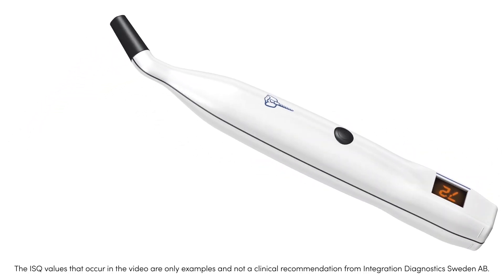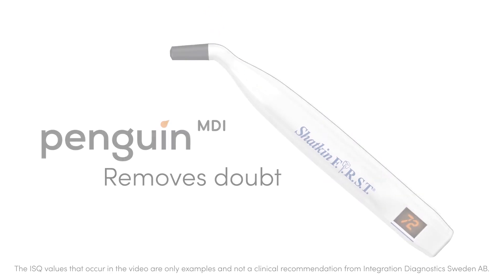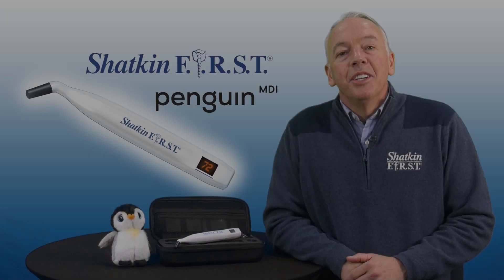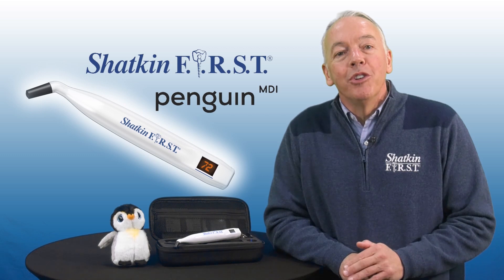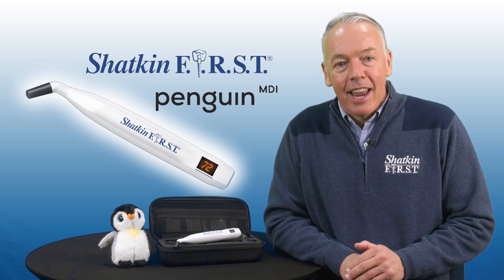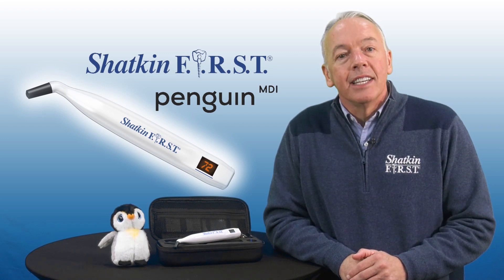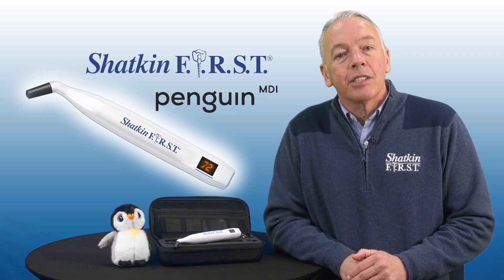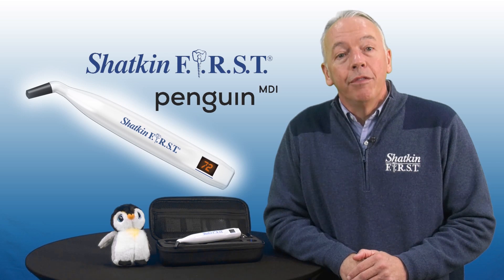The Penguin MDI is available exclusively from Shatkin F.I.R.S.T.. We're very excited to have exclusivity on this brand new Penguin MDI product. Even though this is the first RFA device engineered for mini dental implants, it's based on technology that has been used for many years testing ISQ — the implant stability quotient — on conventional implants.